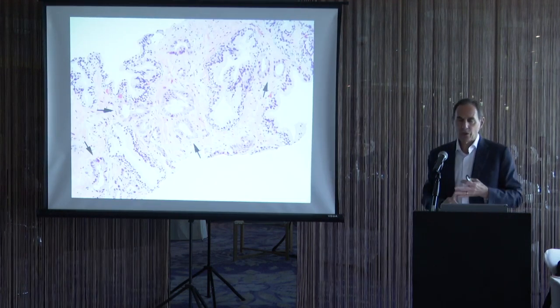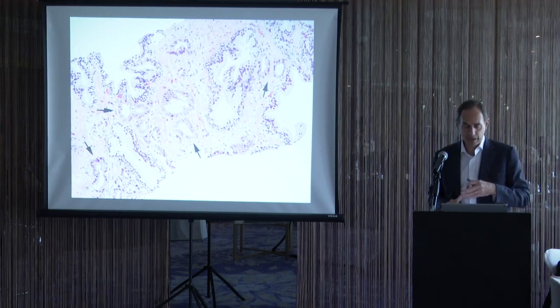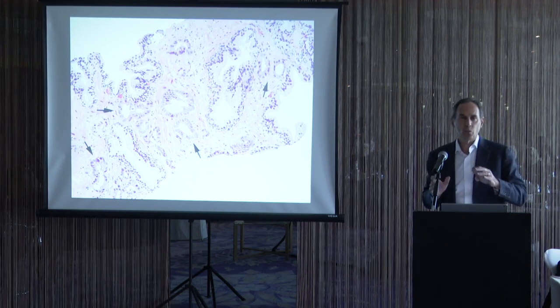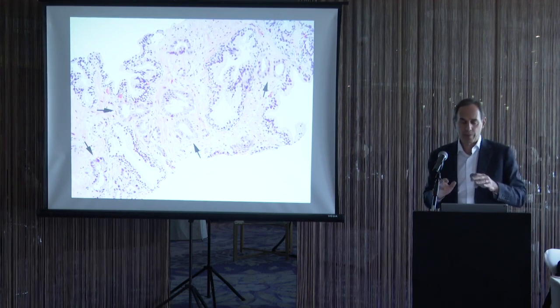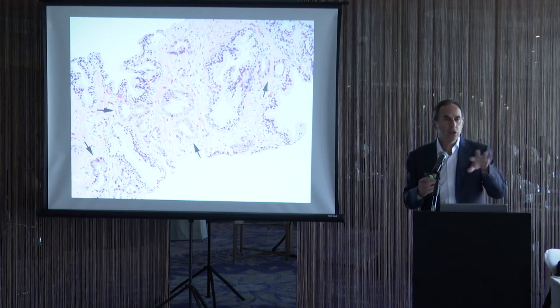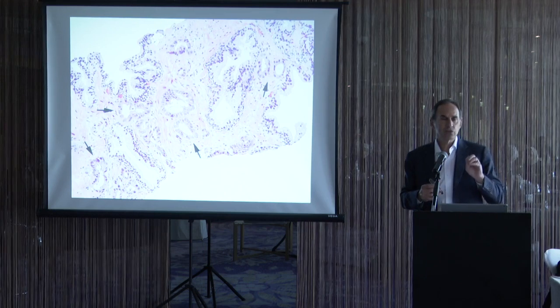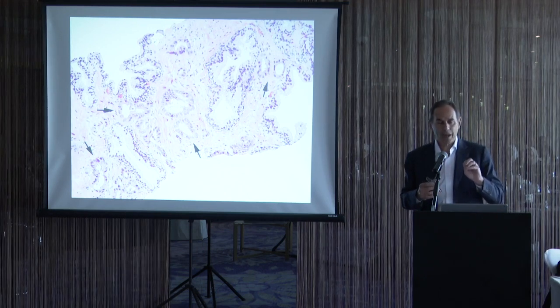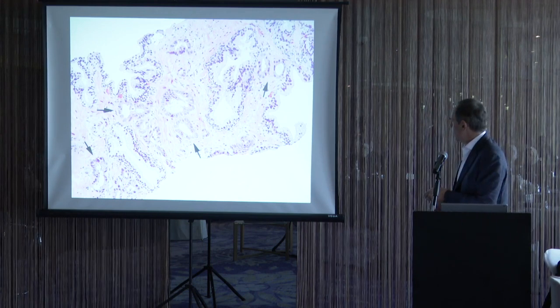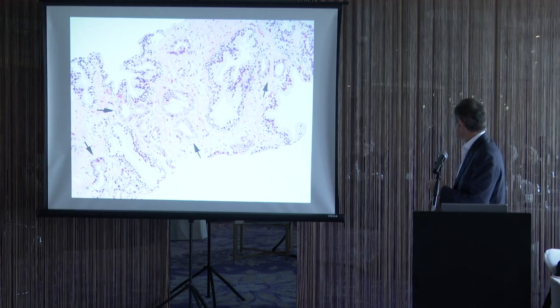Now, in addition to crowded glands and small glands, a more definitive architectural pattern for cancer is an infiltrative growth pattern. Now, you have to be careful when we refer to an infiltrative growth pattern in prostate cancer. I'll show you some mimickers of cancer that can look infiltrative, but when we talk about a specific infiltrative growth pattern that's almost pathognomonic for prostate cancer, what that means is you see an atypical gland, benign gland, atypical gland, benign gland, atypical gland.